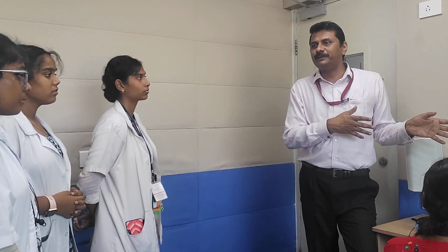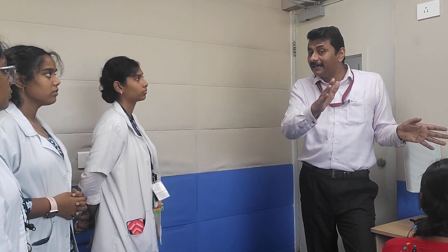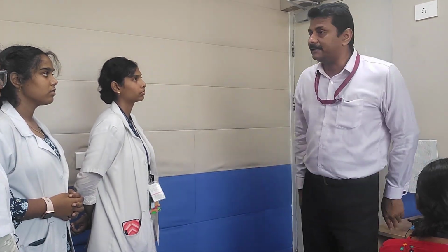So no compromise with the audiometer. This is the best piece of equipment which we have as compared to anything else which you see here. Because it is a subjective test. It's a subjective test, right? The person has to respond to things. If you do not give the instruction properly, or if you do not have adequate amount of caution in going across the procedure, it's not going to work.